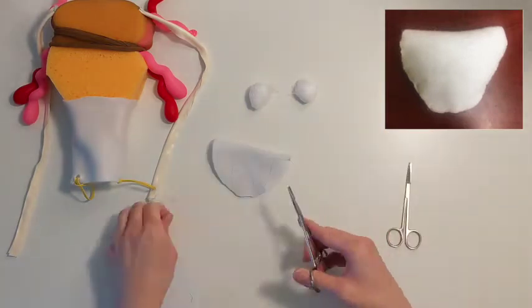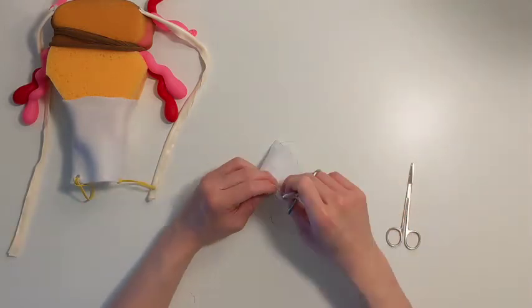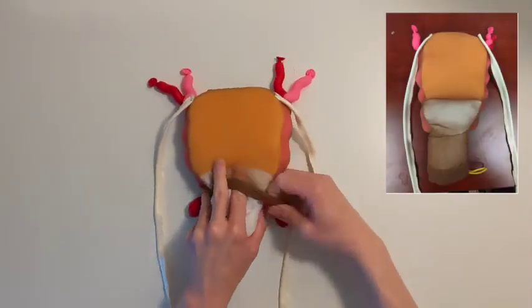After you have sutured about 2/3 of the way, pause to stuff the bladder with 2 cotton balls. Then finish your stitch and tie it off. Place the completed bladder at the lower end of the uterus and roll the knee highs down the bladder and vagina to hold it in place.